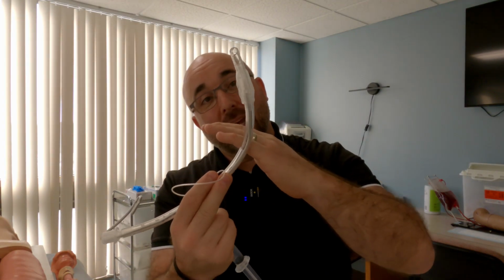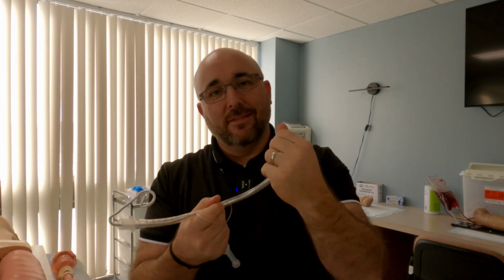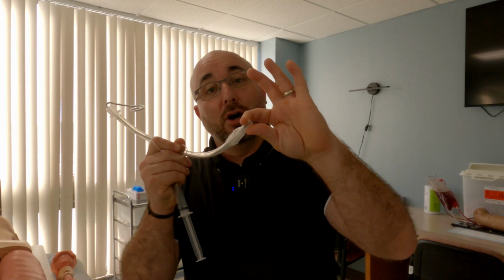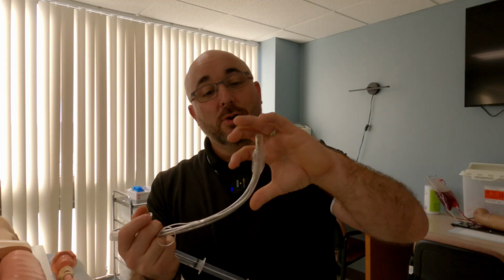Now, one of the areas we like to keep really clean during this is definitely from about this level right here down. And so if all this can be done with that inside of the package, it's really important, because think about this, especially if I had no gloves and I was touching the end of this, or even if I had gloves on, because they can be dirty also, this is going to be below the cuff. This is going to be in the warm, dark, moist area, and definitely can grow bacteria. And you don't want to intubate somebody and have them end up with a ventilator-associated pneumonia or something in the future, because you contaminated this area.